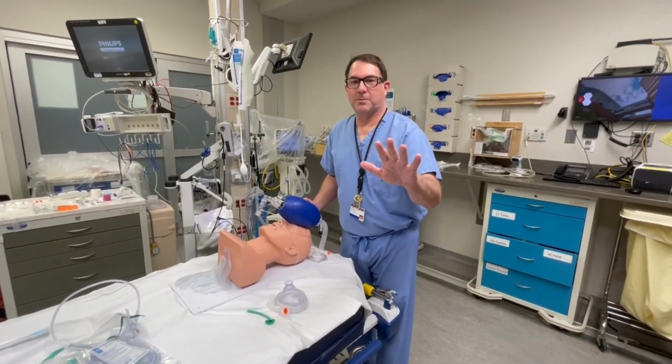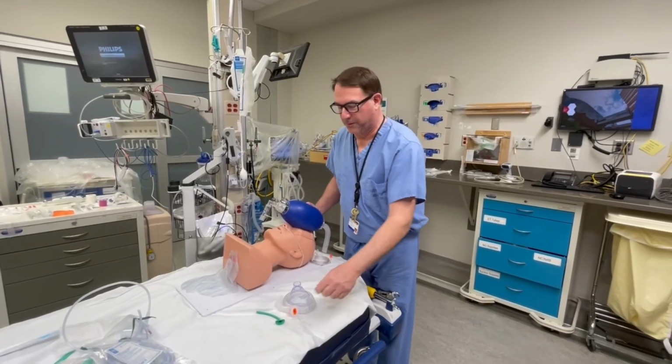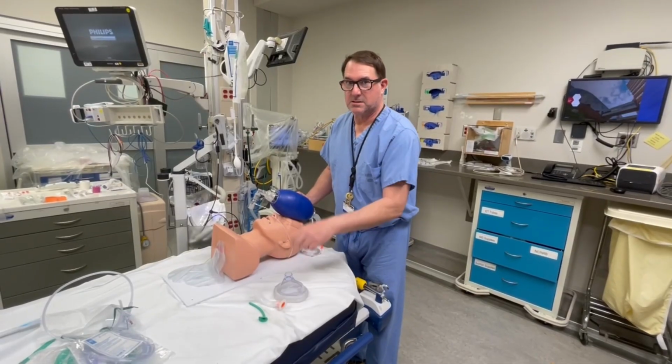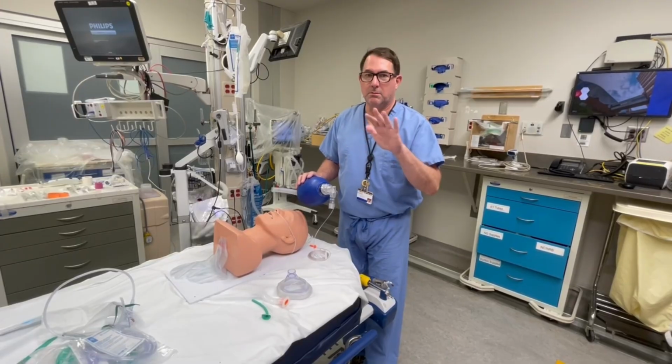Not only you, the therapist, need to know where they are, but everybody needs to know where these are, because when the blade clears the mouth, the first thing that needs to go in is this, maybe this, then this, two-handed, with end-tidal CO2, et cetera, et cetera.